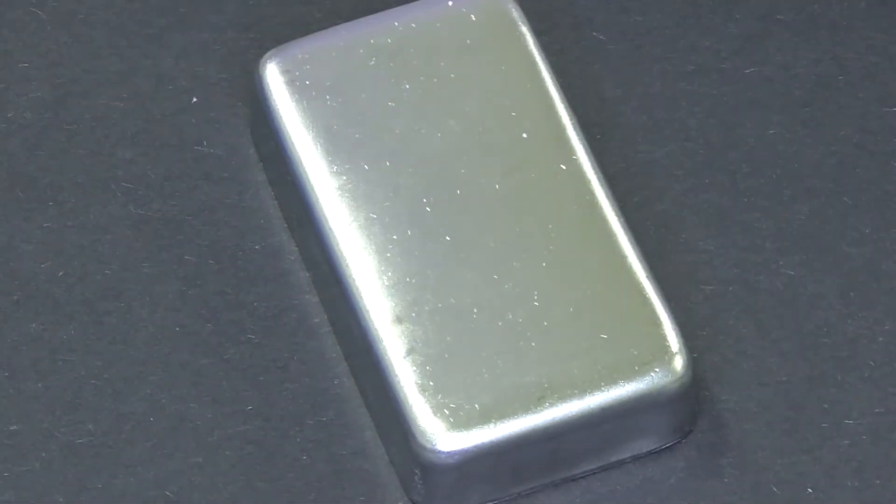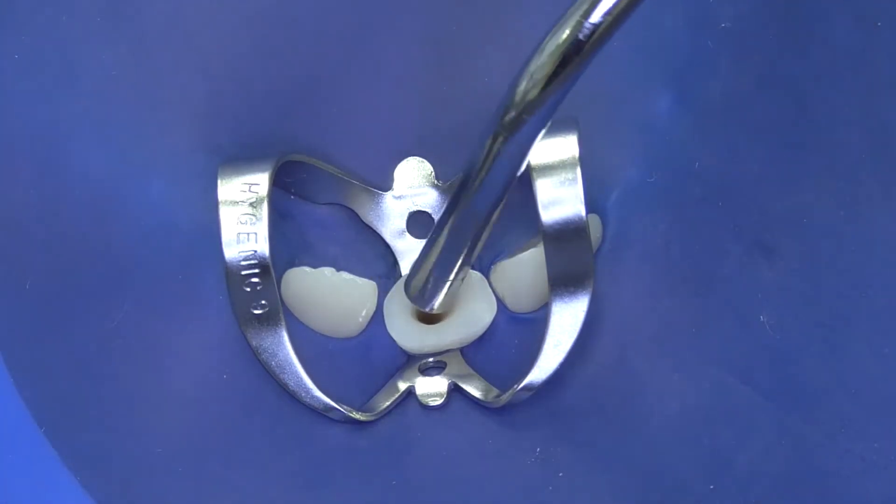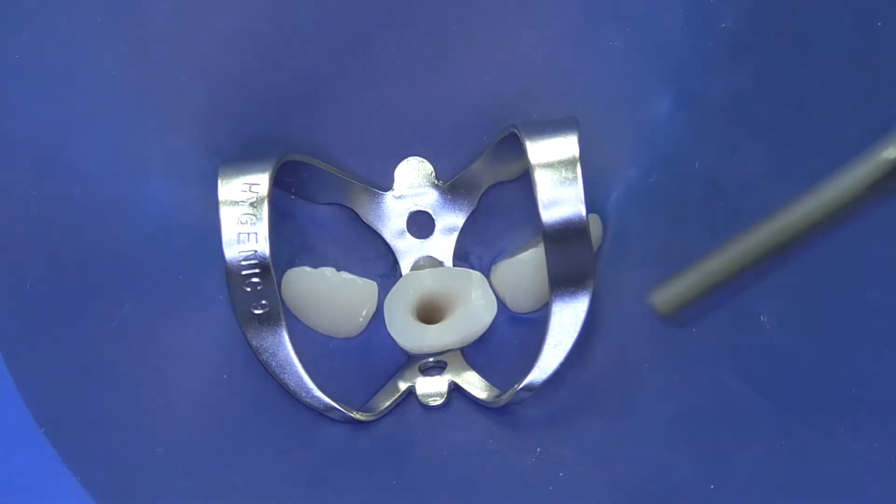After cleaning the dentin, after drying it with air and paper points, we are starting preparation of the bonding of the root canal.